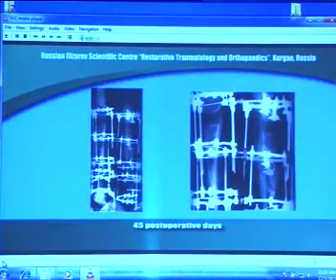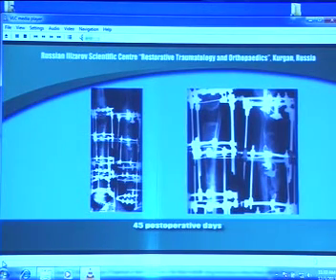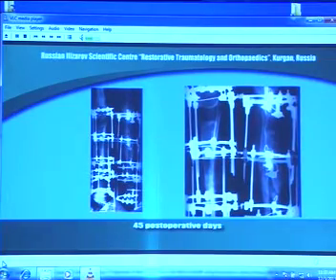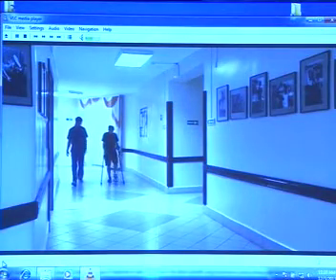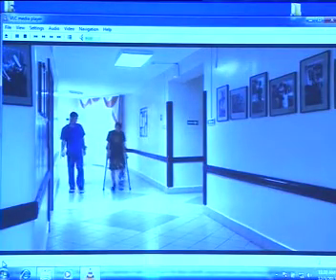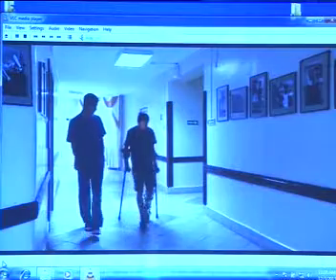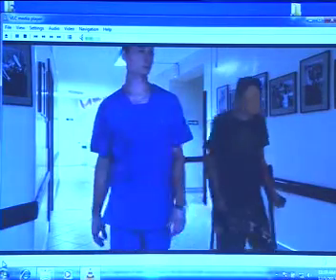Radiographs show a satisfactory docking site in the middle third of the tibia with good alignment and a regenerate bone of moderate optical density formed in the upper third. The patient could walk using crutches and shoe lifts and do physical therapy exercises during the rehabilitation period. Distraction continued to compensate for the discrepancy.